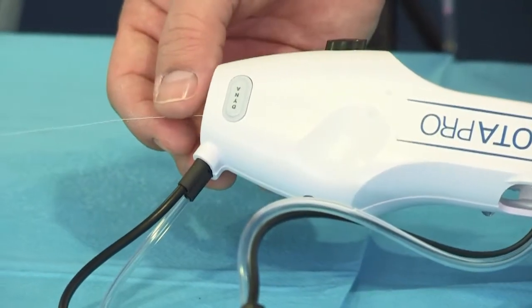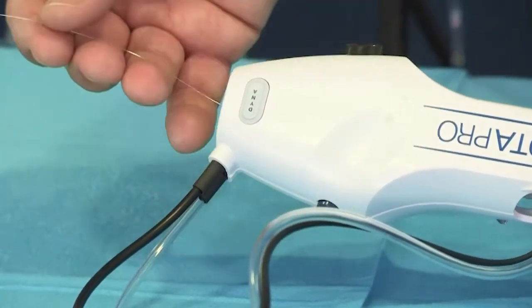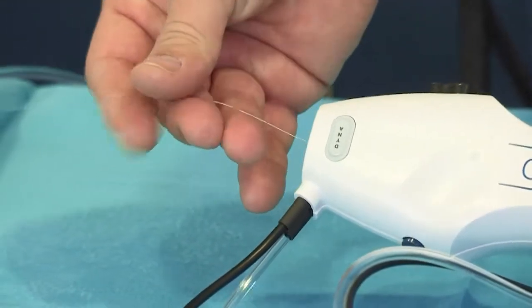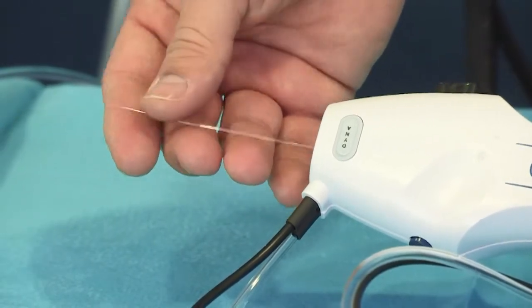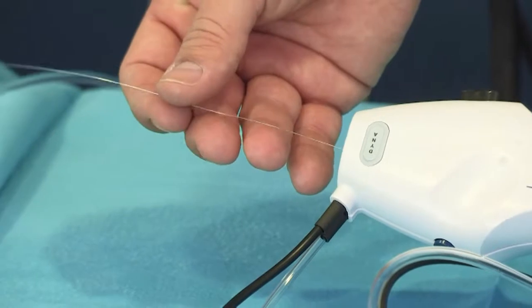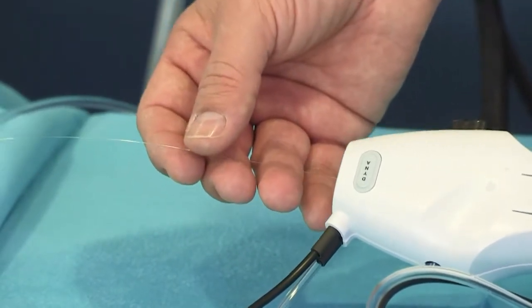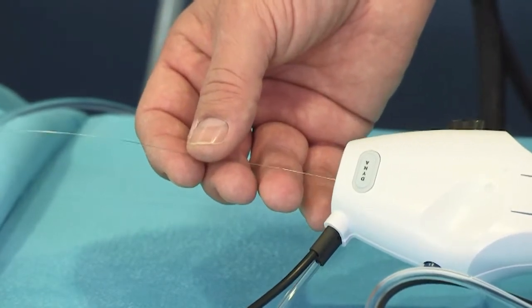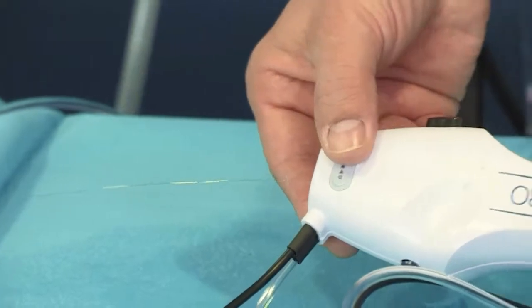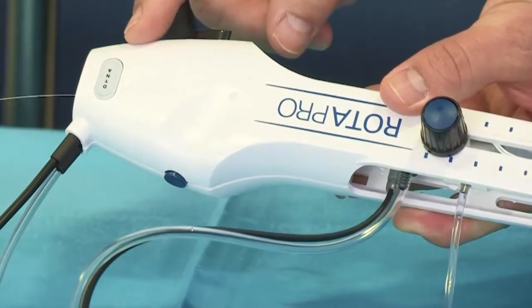The steps are similar to the ones we followed with the old system. The rota wire is in my hand here, and I would like also to mention that if you want to know more details about the rota wire, you can always refer to the videos on PCR Edu online, specifically dedicated to the features of the rota wire. But let's activate now the Dynaglide mode. We push on the button here.